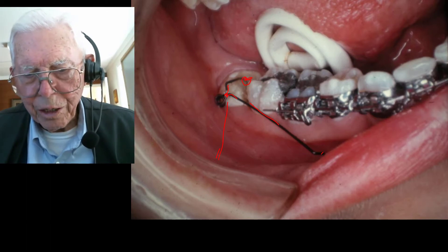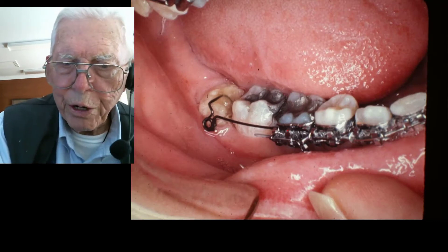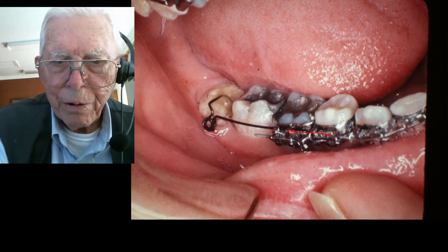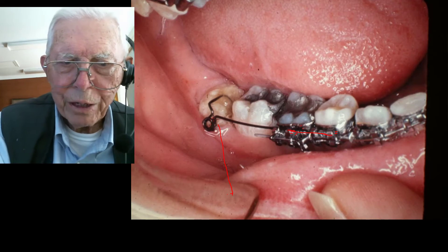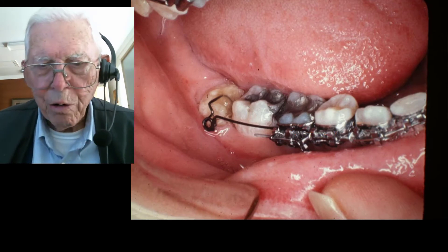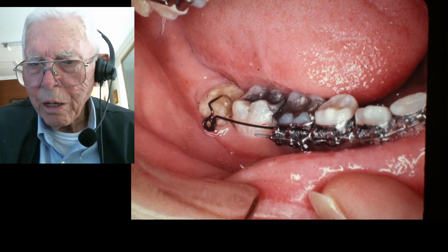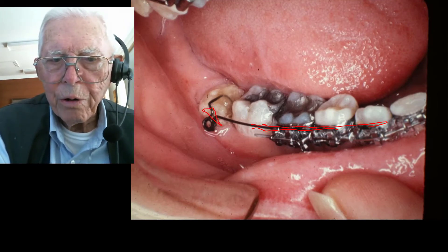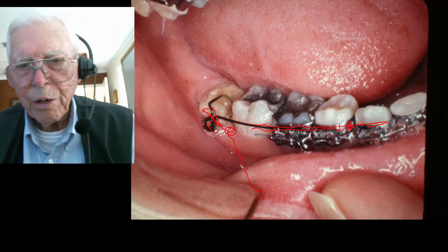We come in and cut that little wire and you have a lot of activation on it. So here we've cut the wire, but first we put it up here on the brackets in this area where it can slide backwards as it opens this gap up here. Now this wire, if you took it out of there, it would go down something like that — so there's a lot of activation in this. This principle can be used whether you're doing orthodontics or not. You can bond a wire on about four teeth and make a spring, put it in a tube over here, and all you have to do is have a wire come in like that.